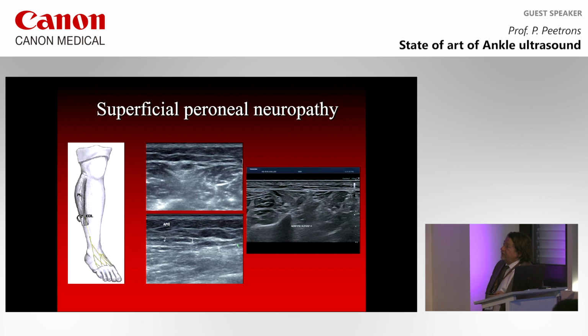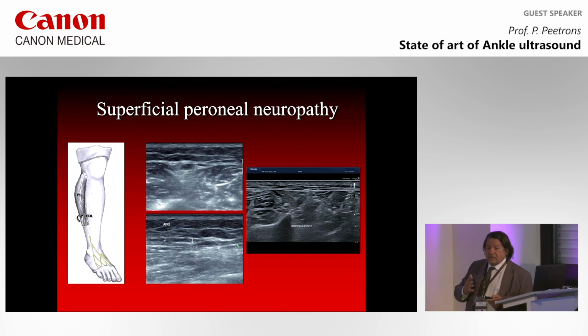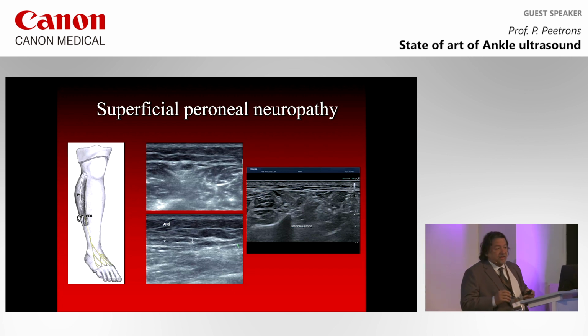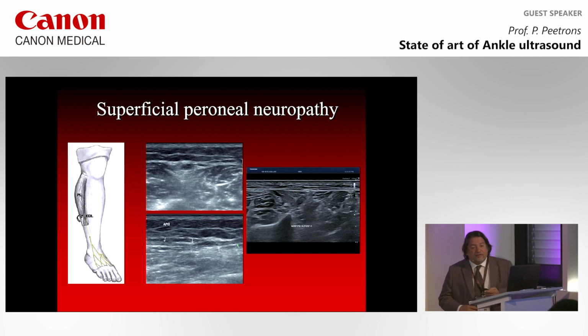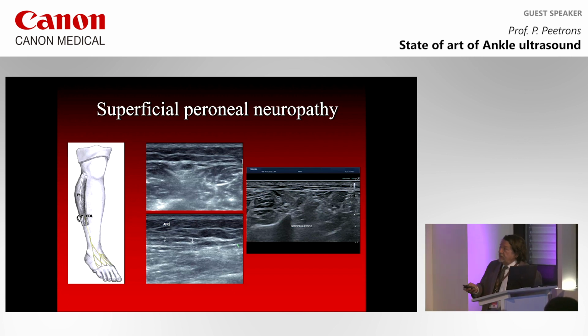So another thing that you have to know, this is an update, we are speaking about updates in ankle sonography, is the involvement of the superficial peroneal nerve. So when you have recurrent ankle sprains, sometimes the reason is not in the ankle itself, it comes from above. It comes from a stretching of the superficial peroneal nerve. I don't know if you remember this nerve. It's coming from the common peroneal nerve. It is following the peroneal muscles, and it's going away from the peroneal muscles there.